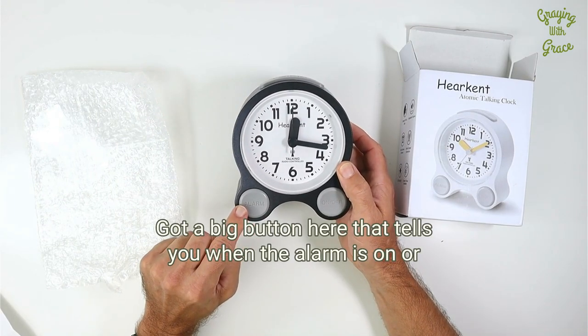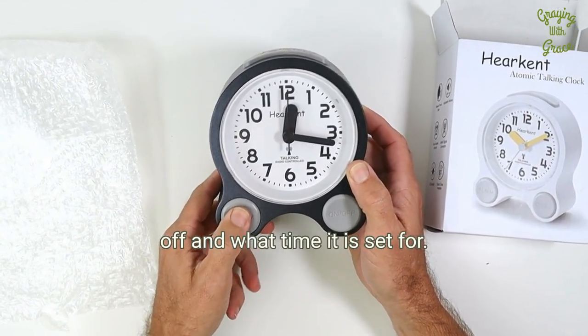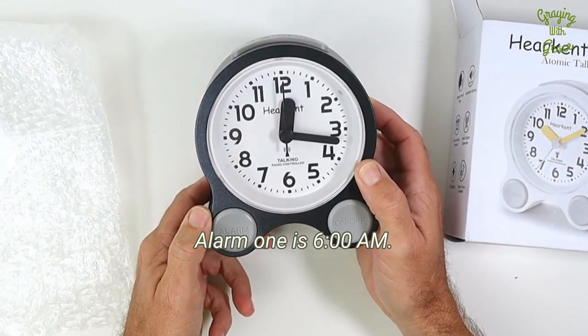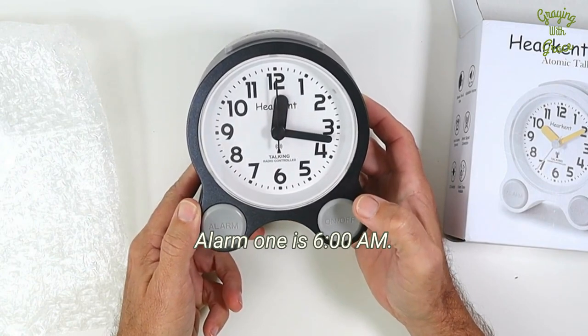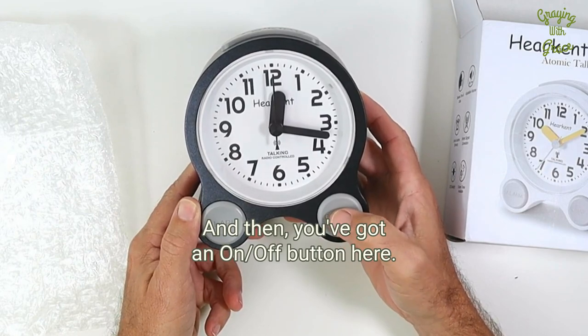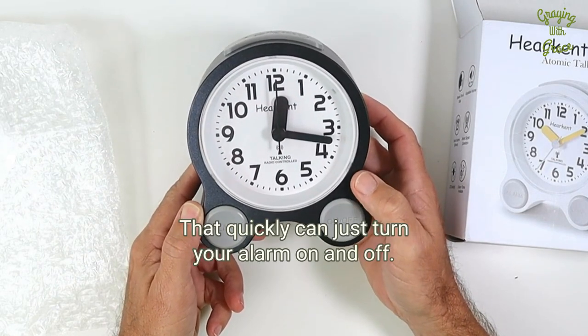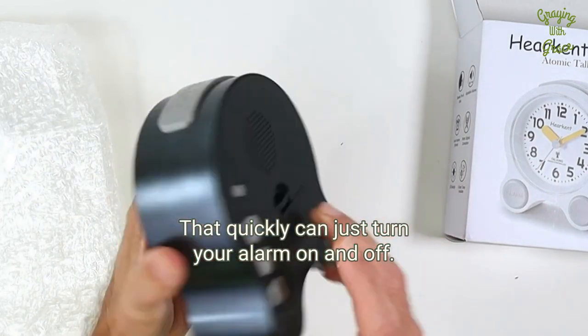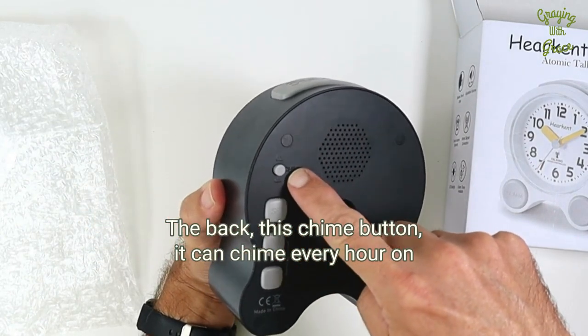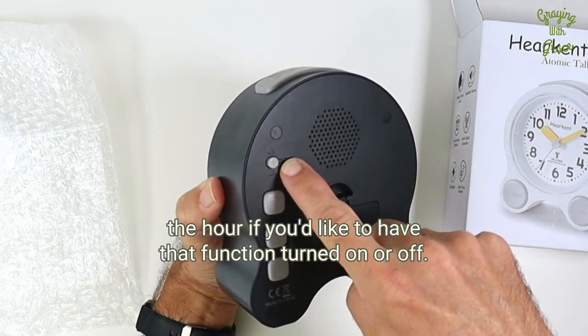There's a big button here that tells you what the alarm is — on or off — and what time it is set for. And then you've got an on or off button here that quickly can just turn your alarm on and off. On the back, there's a chime button — you can chime every hour on the hour if you'd like to have that function turned on or off.